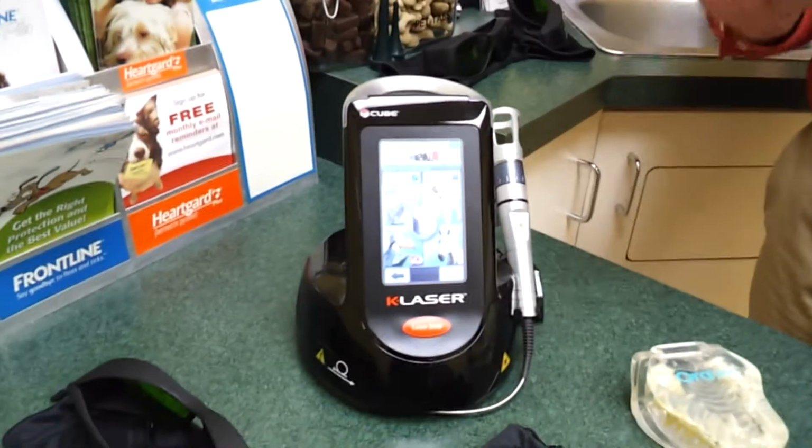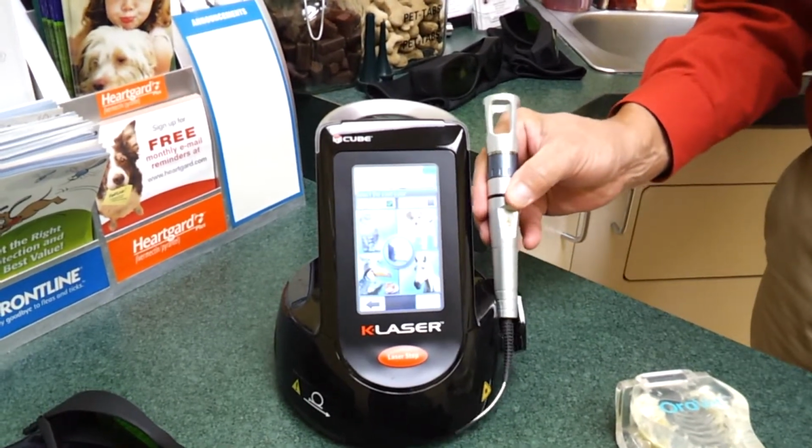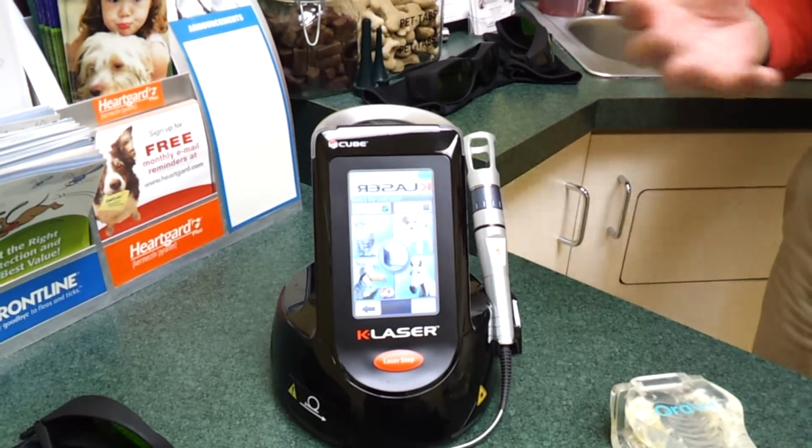The way that the laser works is that it increases blood flow to whatever area that we use this probe on. So what we're doing is we're increasing capillaries, we're increasing the blood volume through the microvasculature, the capillaries. We're increasing oxygen flow, we're increasing glucose or sugar to those tissues, we're increasing getting the electrolytes like sodium and potassium, and we're also allowing those capillaries to remove the bad stuff, which is lactic acid and carbon dioxide. So the laser actually works in many different ways through the same principle, but we can utilize it for different types of organs and different types of systems.